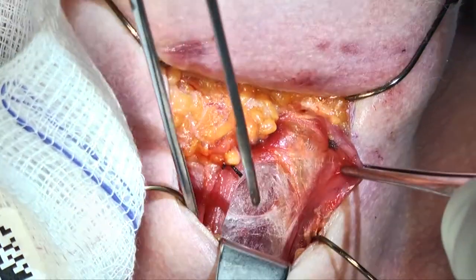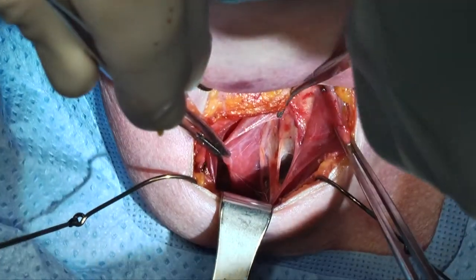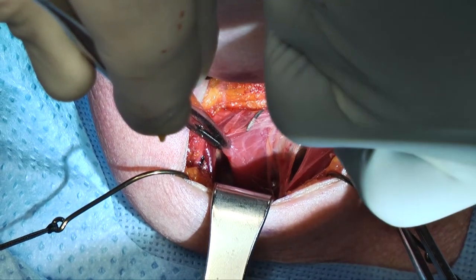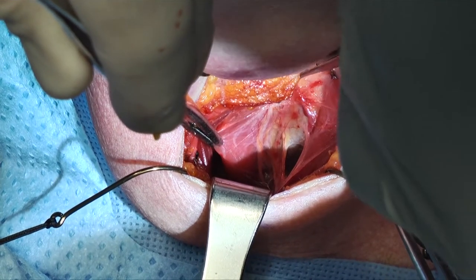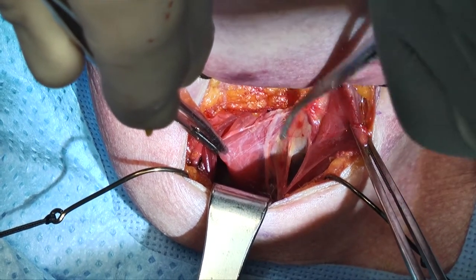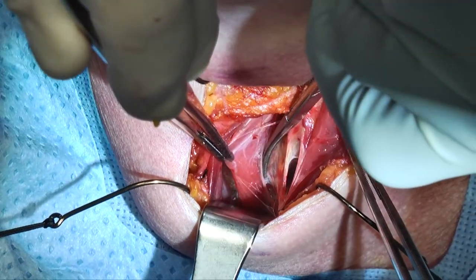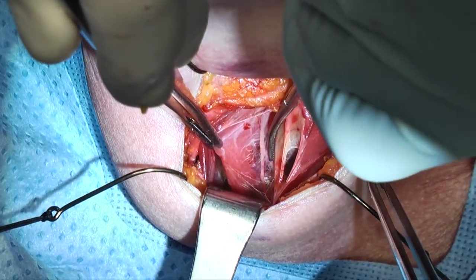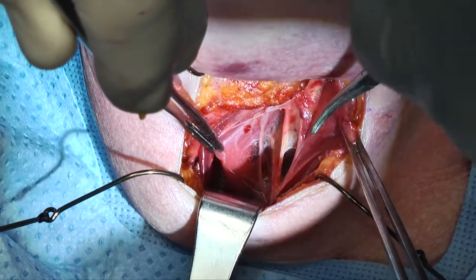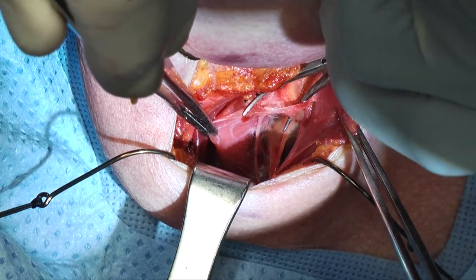Pretty soon you'll start seeing fibers of ansa. We take the Army-Navy retractor and lift up the omohyoid and the SCM together. Then you start seeing branches going up to the straps. Here's a clear view of the ansa cervicalis — a lot of times it's along the lateral border of one of the strap muscles, often the sternohyoid complex. The internal jugular is below.